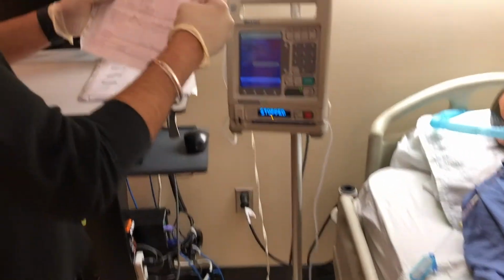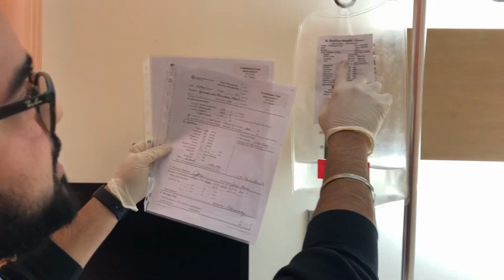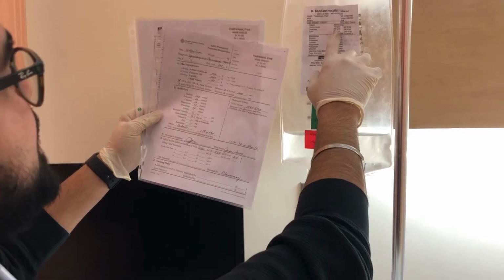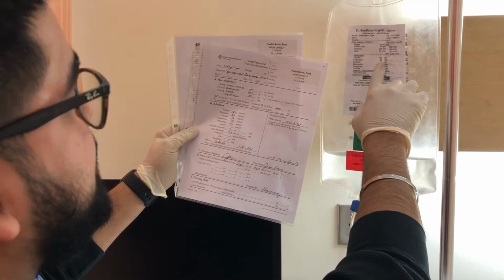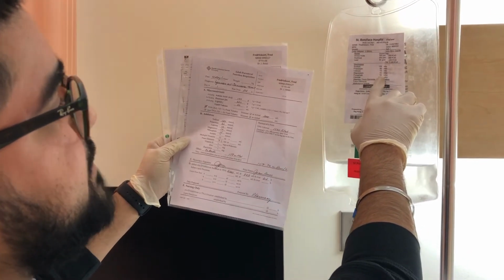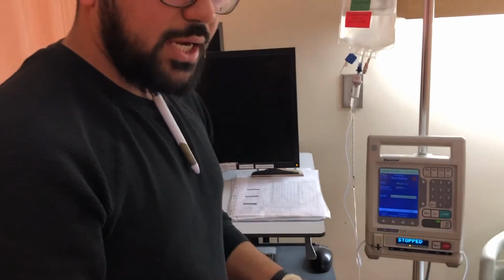The nurse and I can now compare this. We know that it's for Fred Fredrickson, the correct patient. We have the 100 grams of amino acids, 200 grams of dextrose, and 50 grams of lipids, as well as the other ones, so 120 of sodium, 60 of potassium, 10 calcium, magnesium 10, phosphate 15, and chloride 158. Altogether, that leads to the 2000 mLs, and that's our third check that is completed.